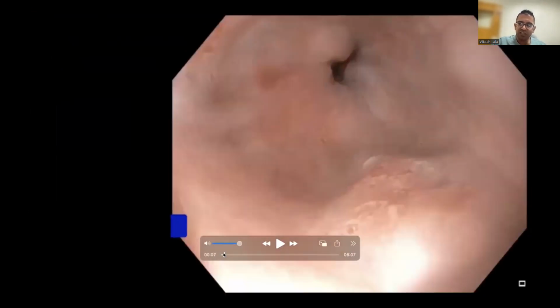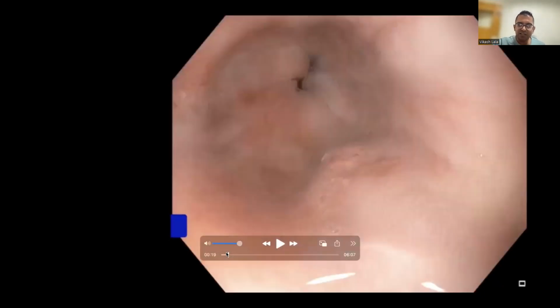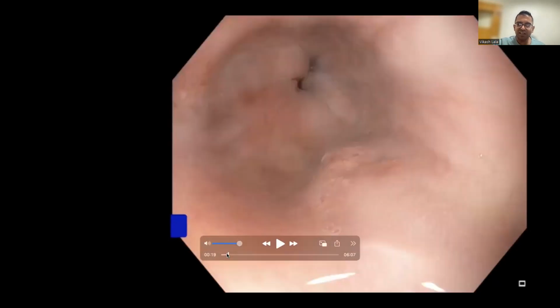So just to take an overall impression, like I said, a blink impression, and you can see that that's the GOJ in the distance. And you can see that there is squamous pretty much everywhere. There isn't much Barrett's tongues. But what you do see with your blink impression is, again, an area of perhaps a bit of extra redness, but certainly bulkiness. And again, bulkiness, nodularity in Barrett's, always concerning. So again, just from your blink impression, you're thinking that's probably where the issue is, where the adenocarcinoma is sitting.